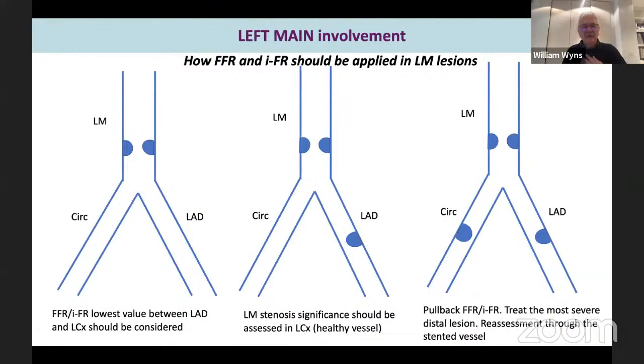I have to say myself, I'm not a big fan of physiology in left main, except perhaps for the situation on the left. Otherwise, I think imaging is probably more important, except perhaps at the end of the case where you want to make sure that the physiology is restored. The situation on the left I like because it shows again the impact of the amount of myocardium that depends on a given stenosis, how it affects the FFR at least, less so the IFR.